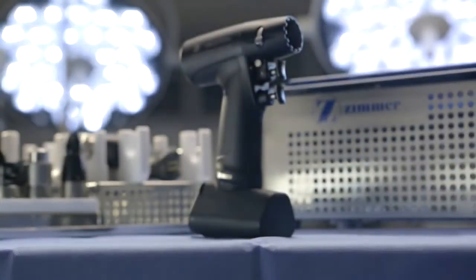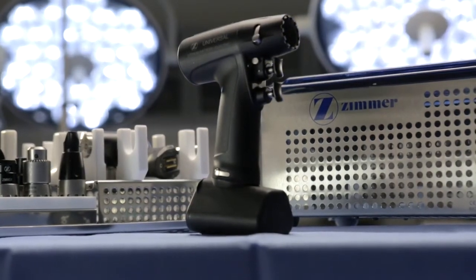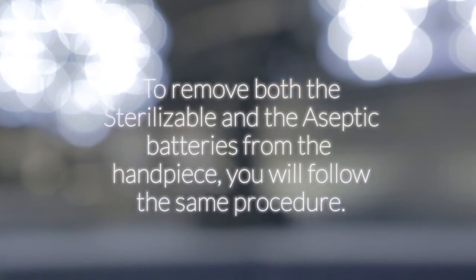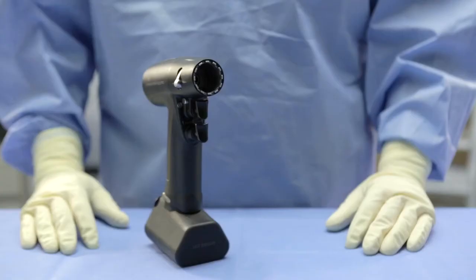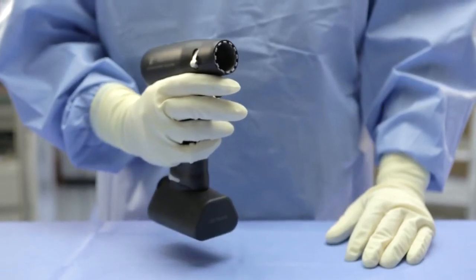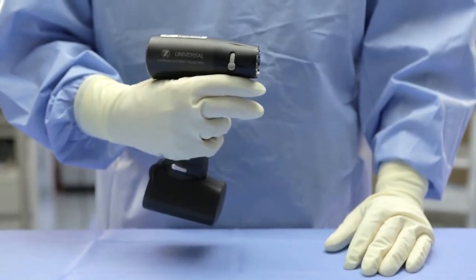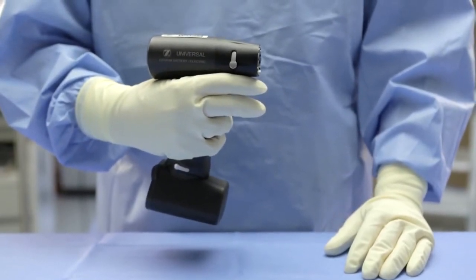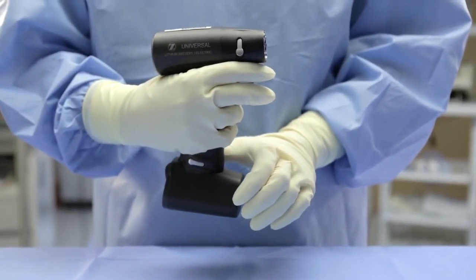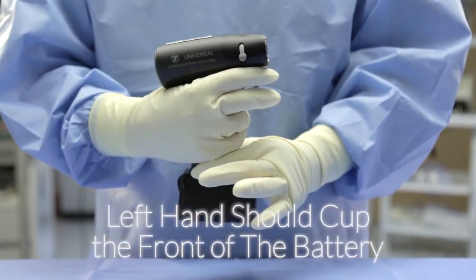When the procedure is completed, you will be required to remove the batteries from the Universal Power System before removing the set. To remove both the sterilizable and the aseptic batteries from the handpiece, you will follow the same procedure. If you are right-hand dominant, hold the handpiece in your right hand just as if you were going to use it. Rotate your arm position so that the nose of the handpiece is pointing to your left. Using your left hand, place your thumb on the detachment lever that is facing you and your index finger on the detachment lever on the opposite side of the handpiece.